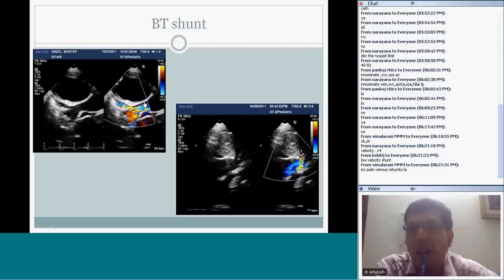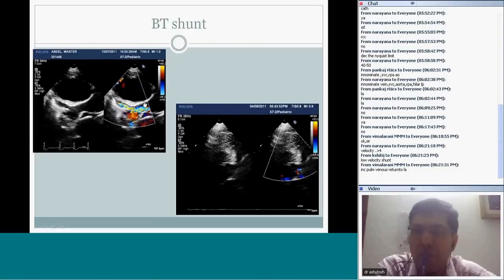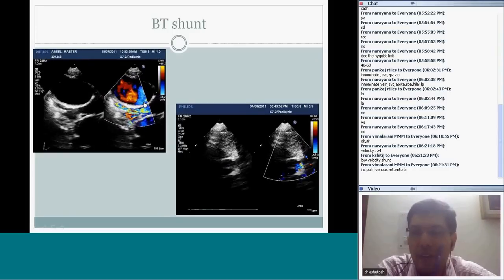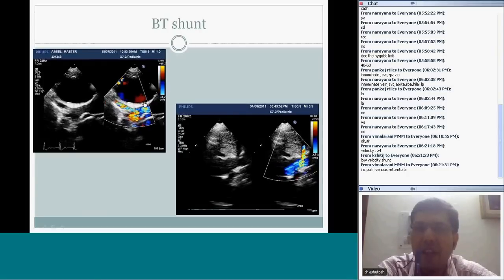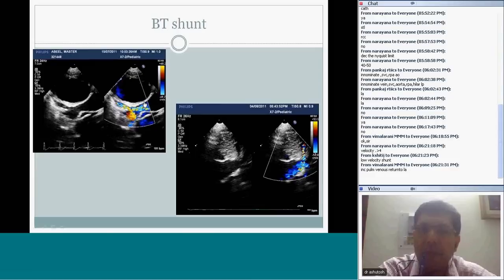There will be some amount of increased pulmonary venous return to the LA whenever you do a shunt in a patient. Velocities around 3 meters per second, which have been reported by radiographers, are supposed to be adequate. Probably 4 or more will mean the shunt is too small. And the shunt, again, is a long segment. It's not just a one-point stenosis, so the velocity should drop through the entire length. So probably 3 meters per second is what has been reported in many textbooks.